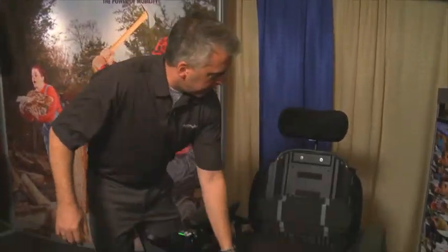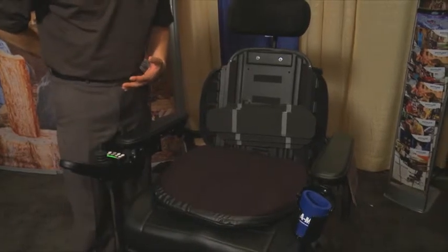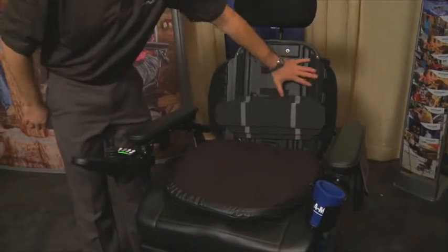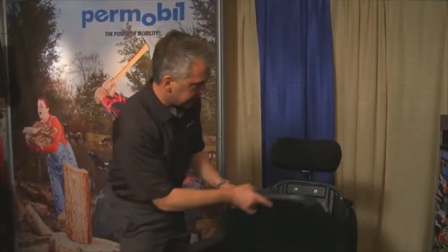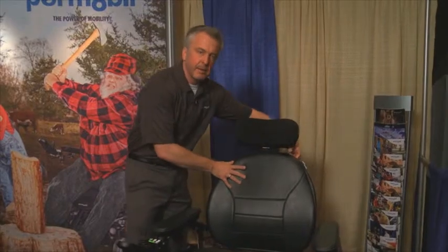The backrest design has been changed to give a wider area of support for the bariatric client, providing a larger surface area. We've also added lumbar shims so you can get good posterior pelvic support and allow extra tissue to go back behind it. The back widths available are 20, 22, and 24 inches wide, giving you enough room to support someone properly. The top of the backrest also pulls over the top of the back to help keep it in place as someone's tilting and reclining.